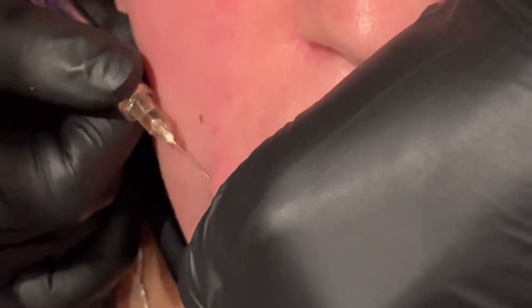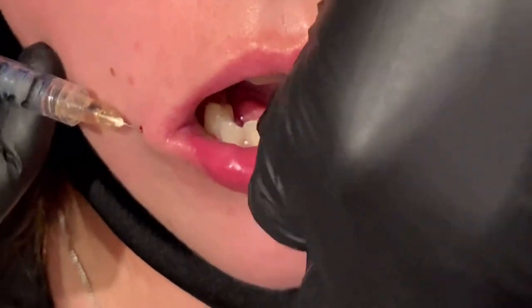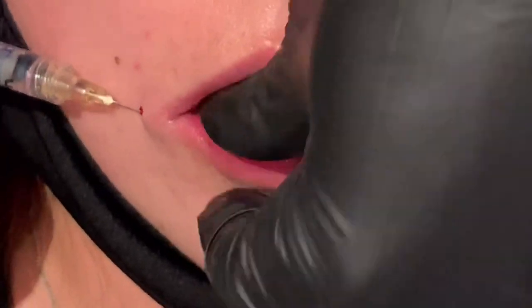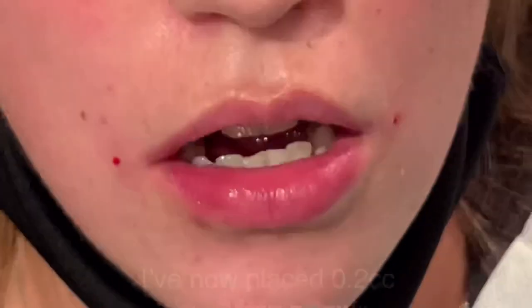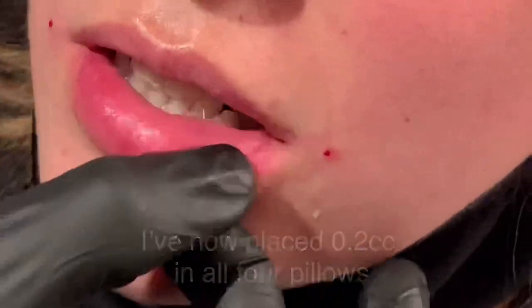I'm likely going to get a little bit of resistance, so I use my index and my thumb and guide the cannula through. I don't want to force anything — I don't want to cause any additional trauma. I'm at the right plane, confirm I'm there with my thumb, placing another 0.2cc in that quadrant for a total of 0.8cc.